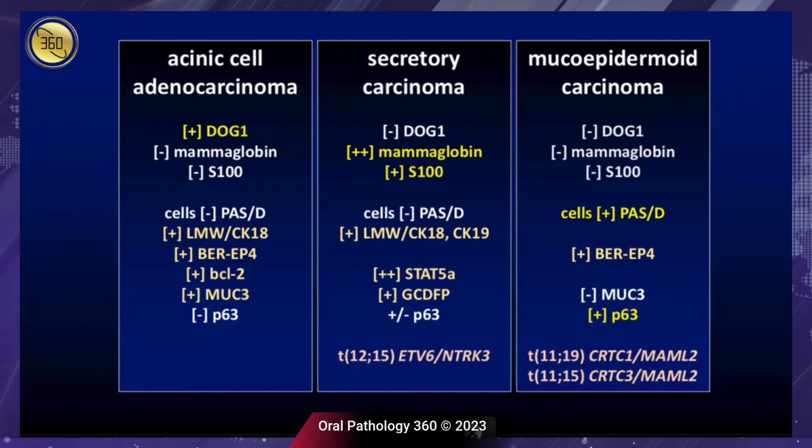It's important because these tend to have a little higher rate of high-grade transformation. The easiest way to tease out a mucoepidermoid carcinoma from secretory carcinomas is with a PAS diastase. Usually it's the secretory product that will highlight and the cells will not. In a mucoepidermoid carcinoma, if you try to highlight the intracellular mucin, it's going to be the cells that highlight, and they will also be negative for DOG1.